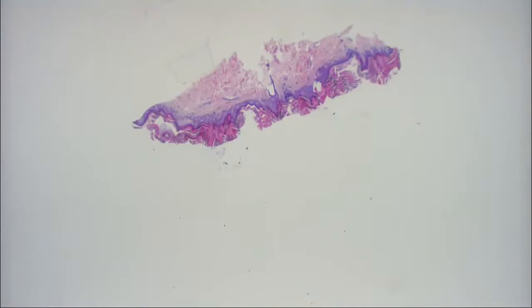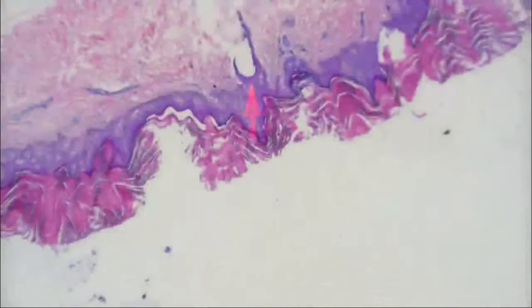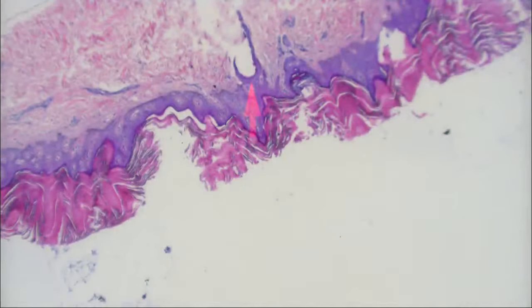Well, what's the pattern of the epidermis? It's papular. Yeah, that's correct. Notice that it's kind of papillated or even digitated. So what's the difference between digitated and papillated? I think about maybe a seborrheic keratosis or something like that. Digitated is usually more like finger projection. Yeah, good. It's more like spikes almost, whereas papillated is more like gentle papillae, nipple-like projection.